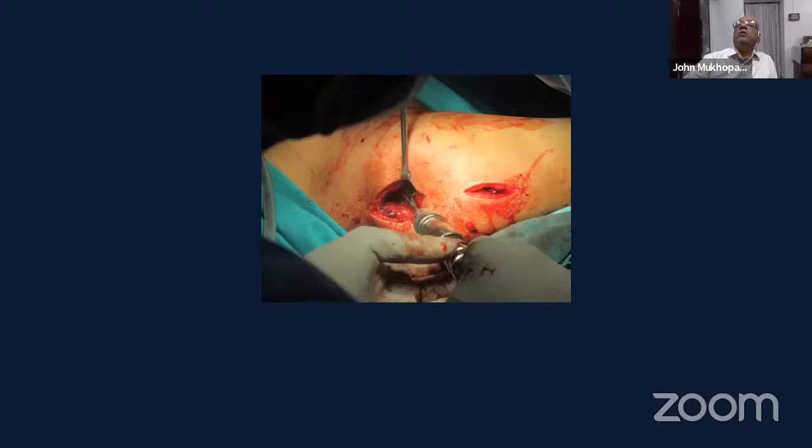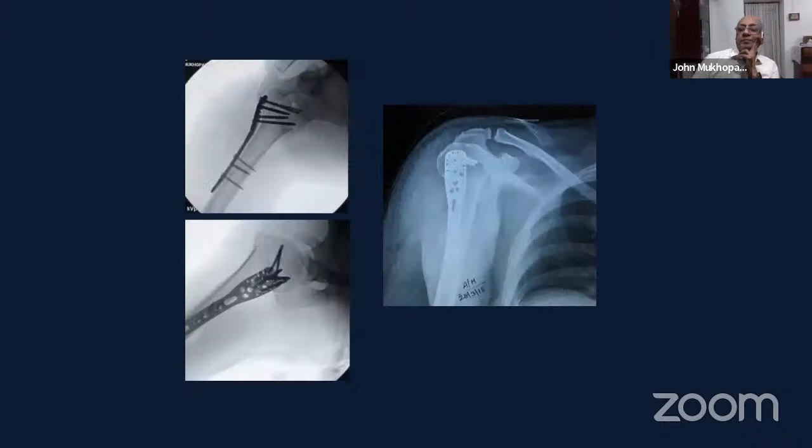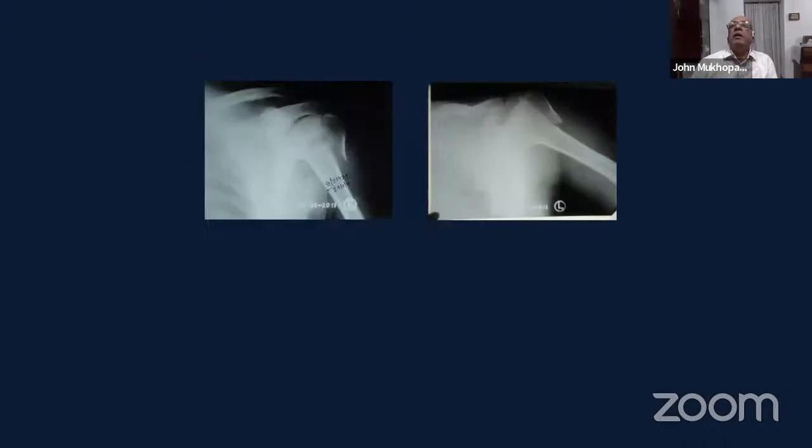Okay, so this would be your fixation. This is using the torque limited screwdriver. And that's your immediate post-op X-ray. You can see how we have not put any screws in the region of the axillary nerve.